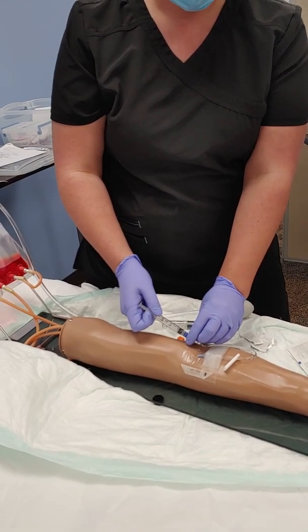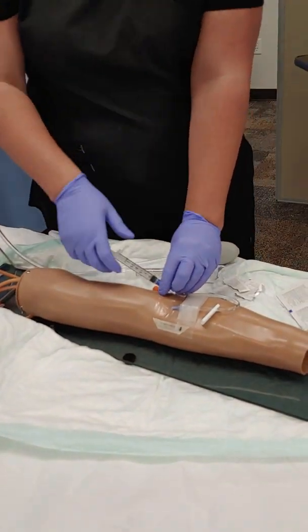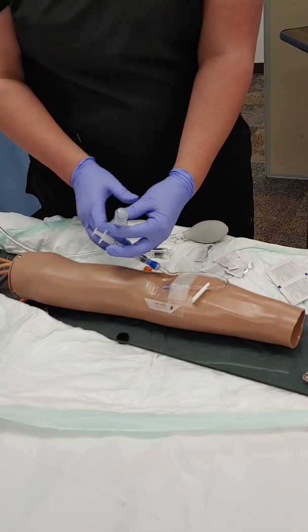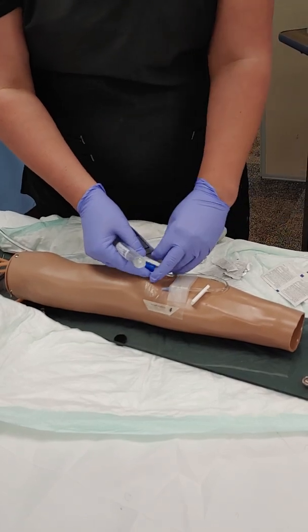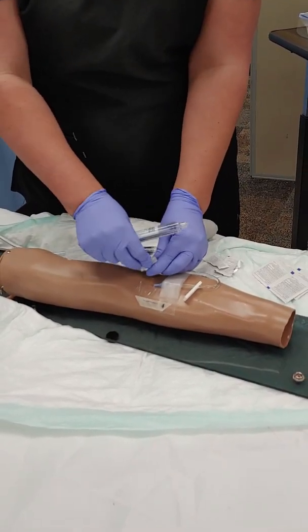While administering med, observe for adverse reaction. If it occurs, stop infusion and notify MD. Okay, patient's not having a reaction. They're doing good. Remove med syringe. Wipe port with alcohol pad. Insert saline syringe and instill flush solution at same rate as the administered med. When done, clamp extension tubing.